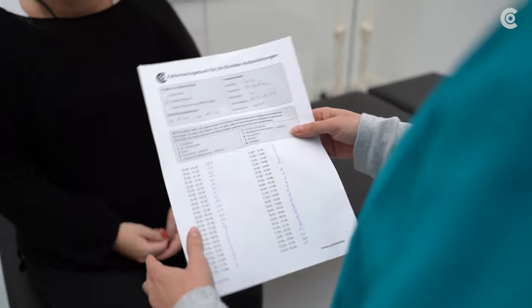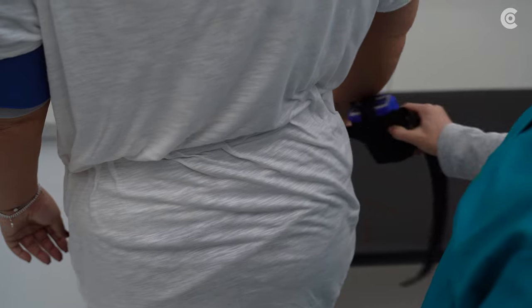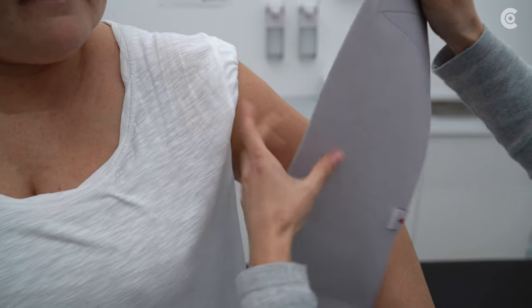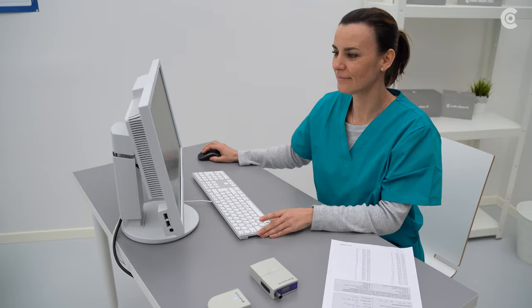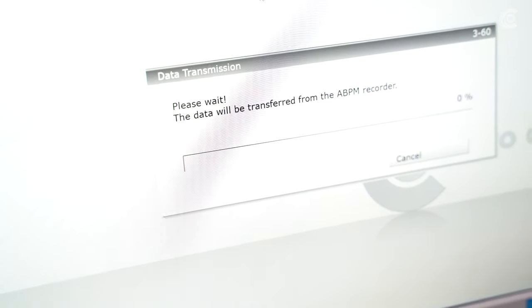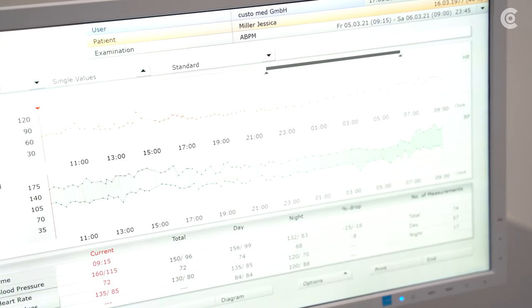Back in the doctor's office, ask the patient for the diary and remove the CustoScreen 300, the cuff, and the Screen Protect. Then download the data from the device via the infrared interface and the software. You can adapt the individual phases, such as the day and night phase, by using the patient diary.